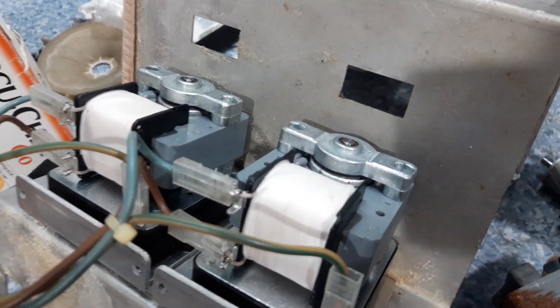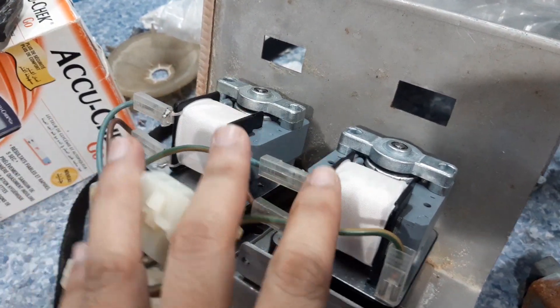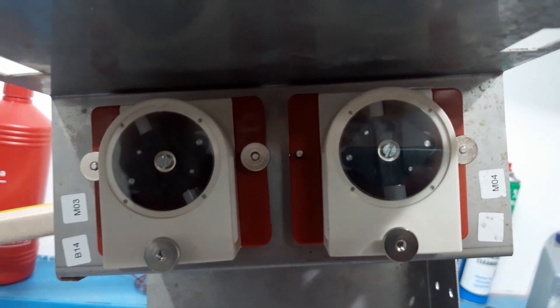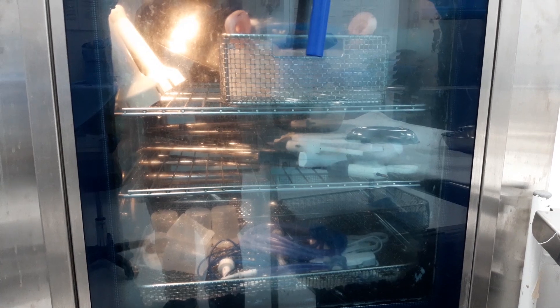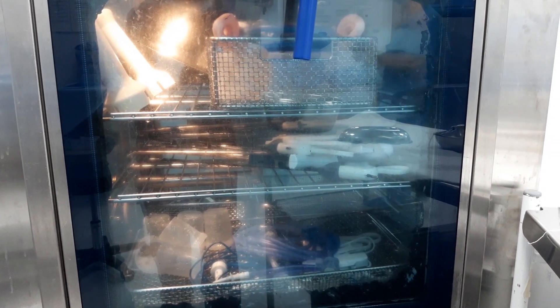Okay guys, in this video I am going to replace a dosing pump of a washer disinfector. But before anything else, let me explain to you what is a washer disinfector.